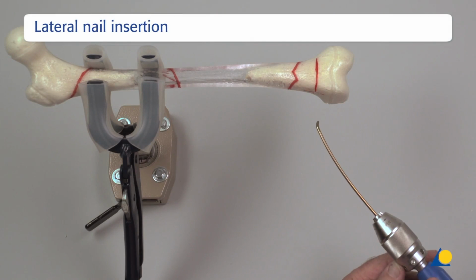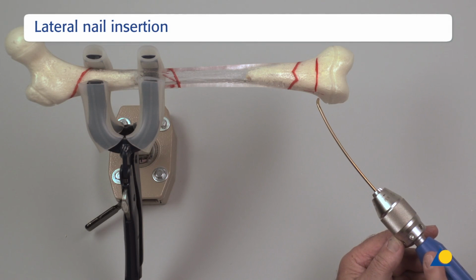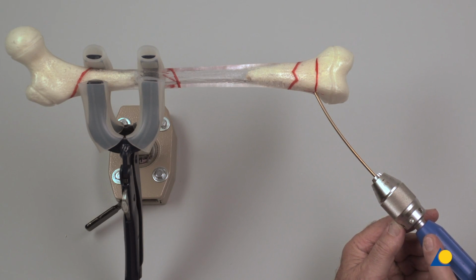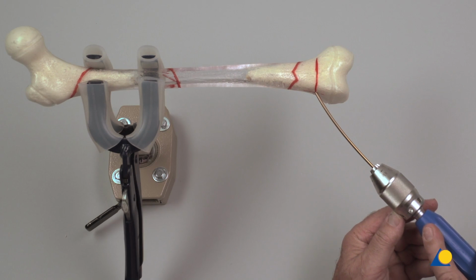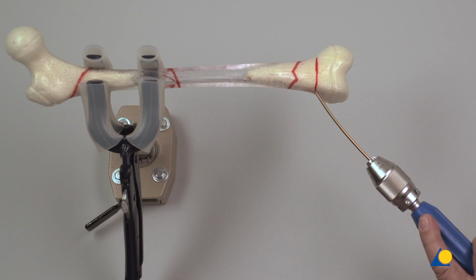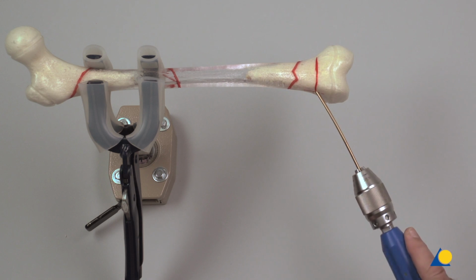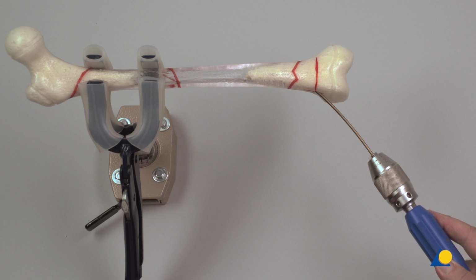The first nail is loaded in the inserter. The laser marking is aligned on the straight nail end with one of the guide markings on the inserter or aligned to one of the inserter bars. The nail is inserted into the medullary canal with the nail tip at a right angle to the bone shaft and then rotated through 180 degrees with the inserter. The nail tip is aligned with the axis of the medullary canal.